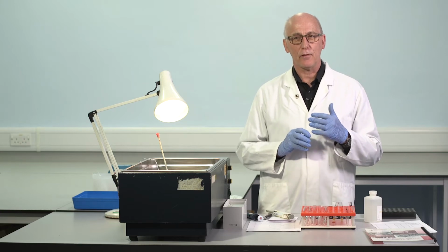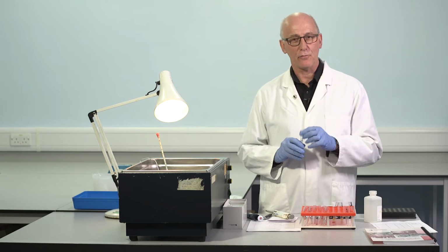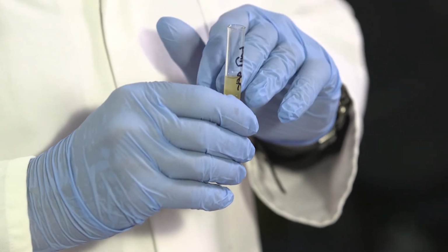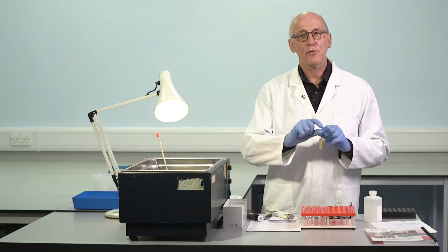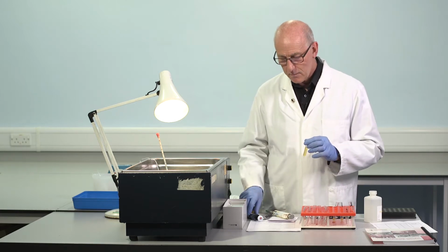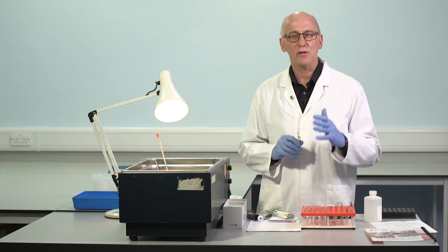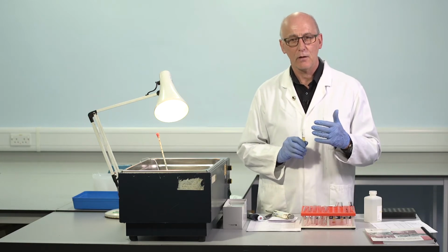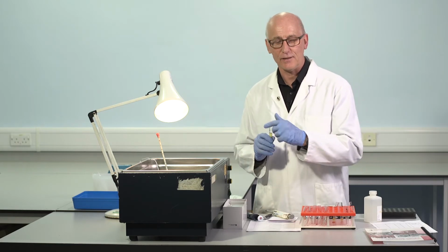We need to be sure that all the factor VIII deficient plasma we'll need for this batch of work is ready and prepared and forms a single pool. So what do I mean? In this case, we have around 3 mils of factor VIII deficient plasma. Each of those was a single freeze-dried 1 mil vial. But I've prepared those and pooled the 3 vials. This way, if there is any small difference in the filling of those vials or in the reconstitution, it disappears when I make the mix. It's a single mix, and it will be the same then for each of these tests.